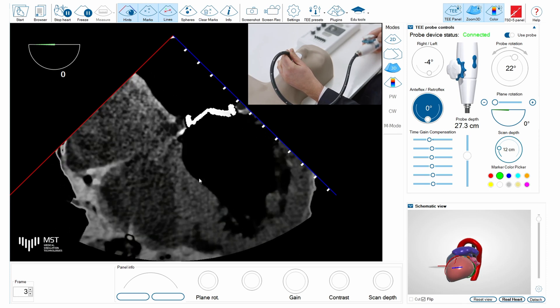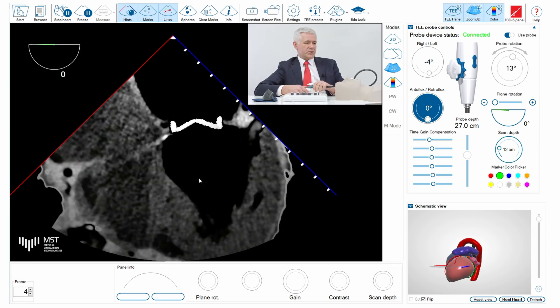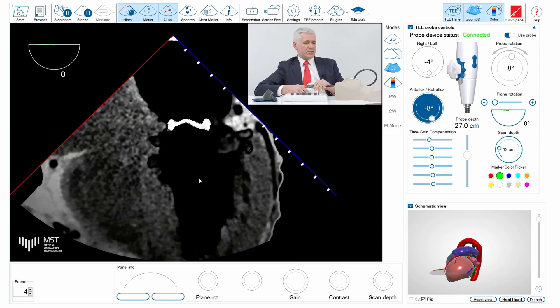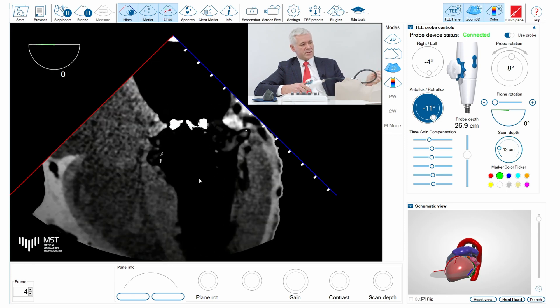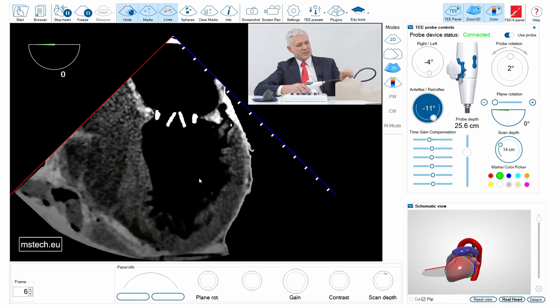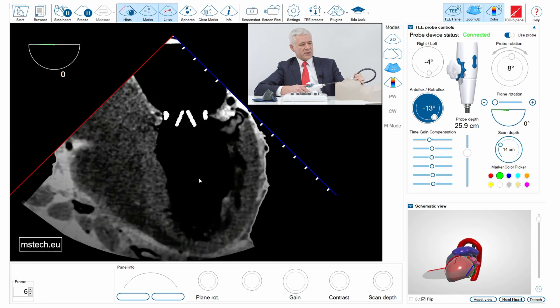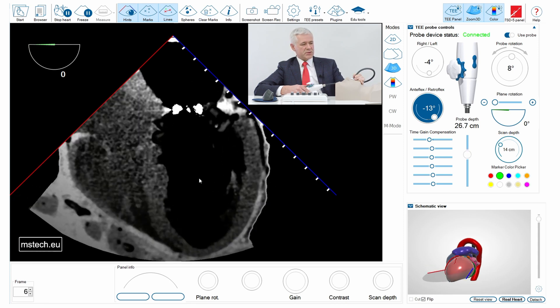So here is the four chamber view. I'll do a slight retroflex just to make sure that the left ventricle cavity is as long as possible, and I position the valve in the center of the screen.